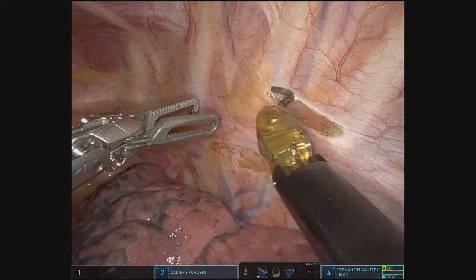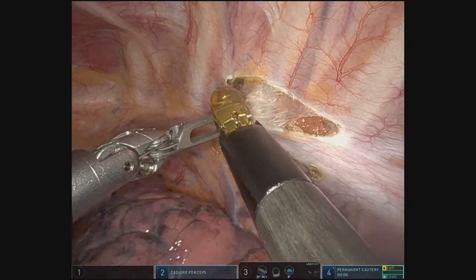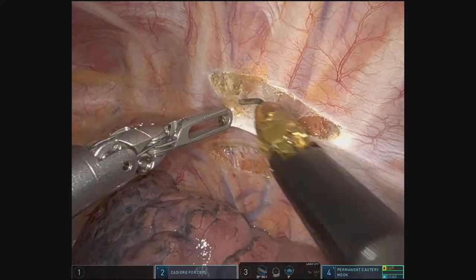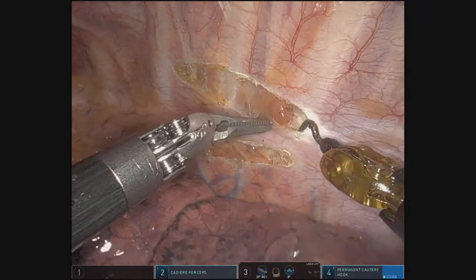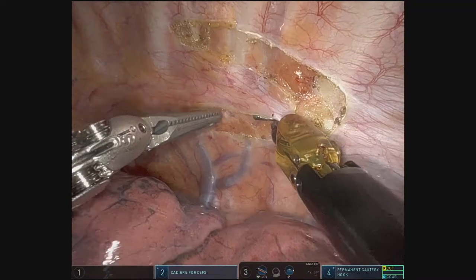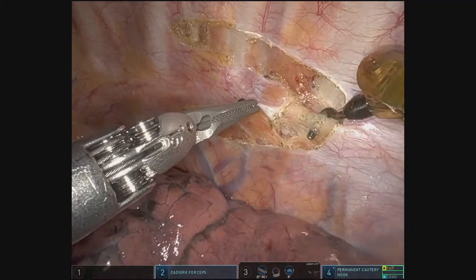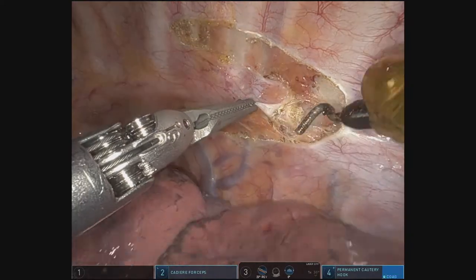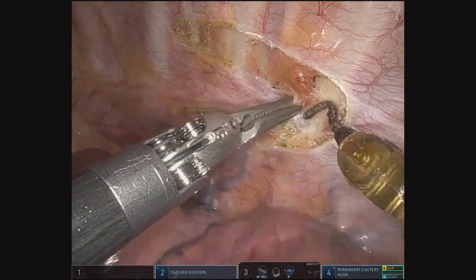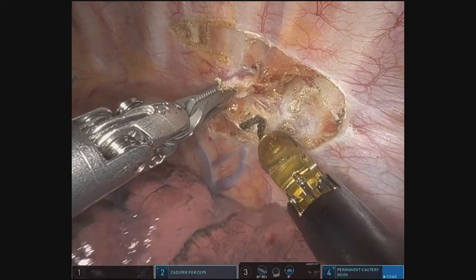The sympathectomy is performed between levels T3 and T4. We use a hook cautery and essentially mobilize the pleura. Here you'll see the sympathetic chain coming around right there along the hook cautery, which is then cauterized. The chain is taken up all the way to the level of about T3 and then ligated again.